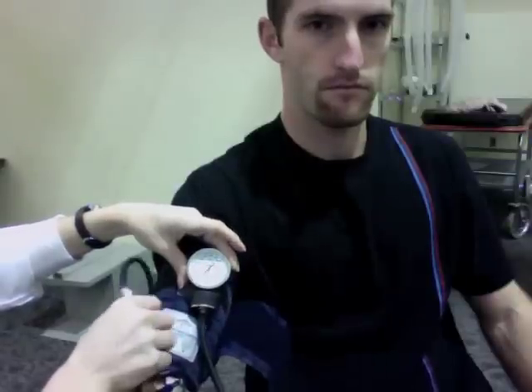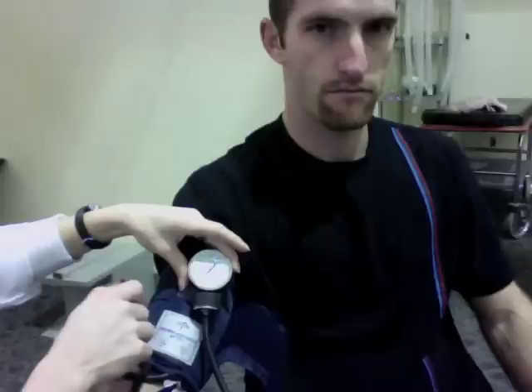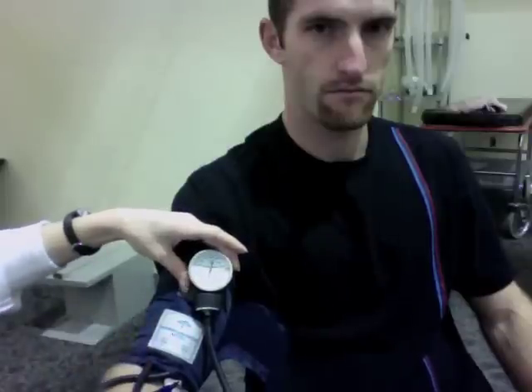Blood pressure is an ever-changing element of a human's physiological makeup, and so one reading, therefore, must not be considered a subject's definitive blood pressure. Multiple tests spread throughout the day and averaged will give a more appropriate diagnosis of cardiovascular health with regards to blood pressure. Faulty devices are always an issue when using medical equipment, and the device should be maintained and stored correctly. This is especially important for the aneroid manometer, which requires frequent calibration.